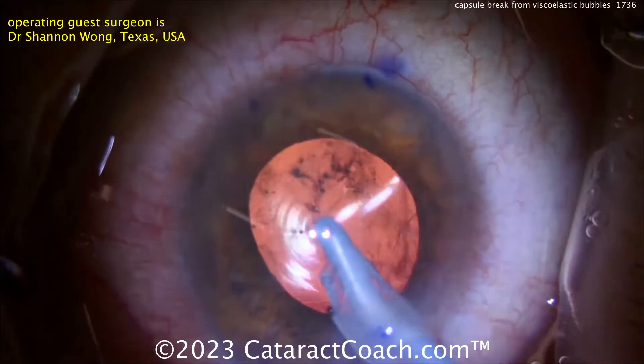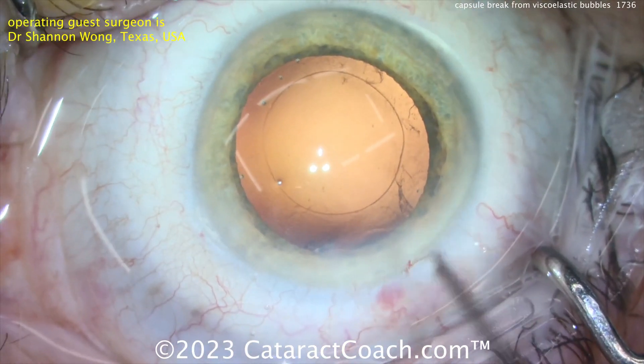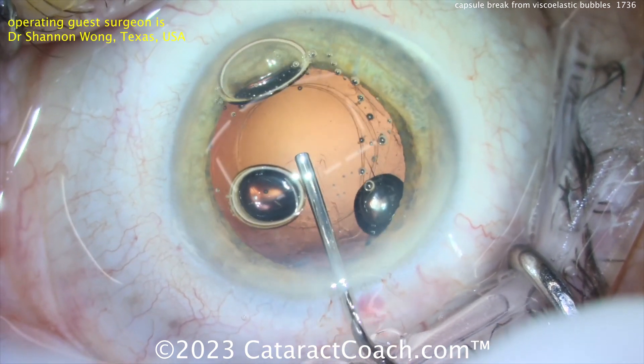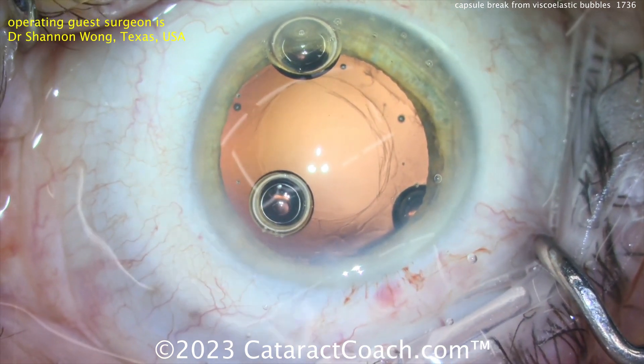Amazingly, this isn't the first time Dr. Wong saw this complication. In another case, the empty capsular bag is ready to receive the lens, viscoelastic is injected — boom — causing a big break in the posterior capsule. The posterior capsule is now wide open.